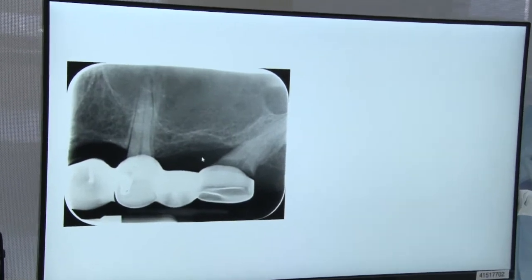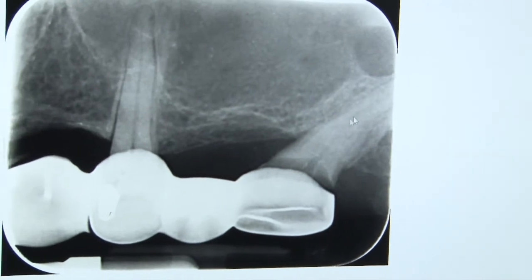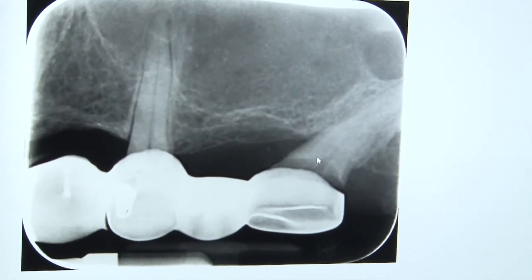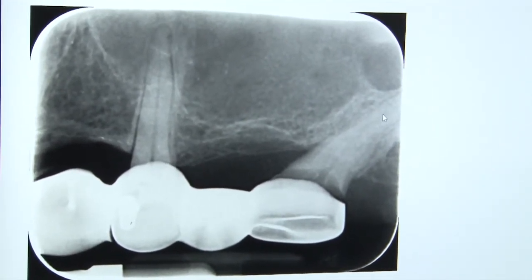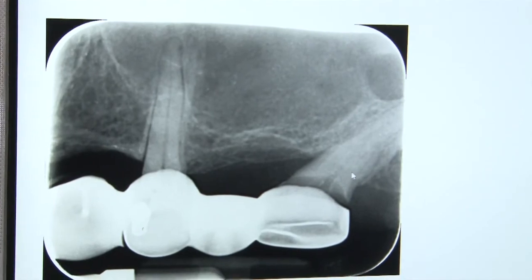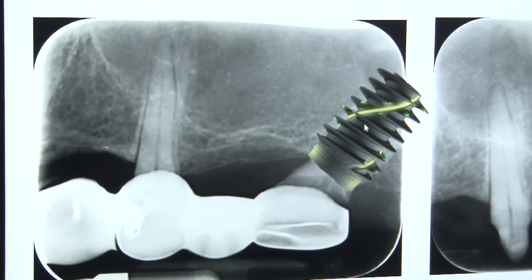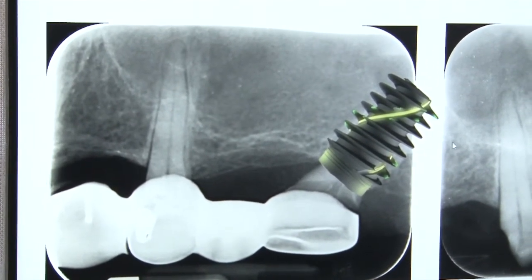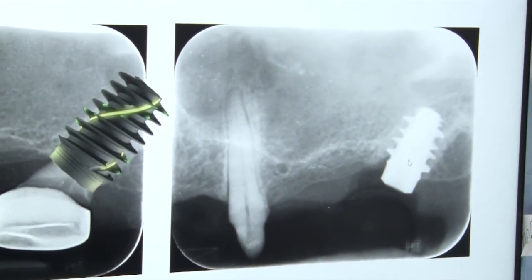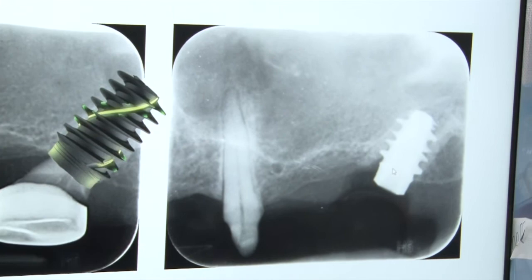Take a look at this radiograph here. The patient is obviously going to lose this bridge and this tooth, but wouldn't it be amazing if we were able to extract the tooth and to be able to place an implant directly into that socket? We can do a junction between a natural tooth and the implant further in treatment, but it has turned out to be surprisingly very easy to place an implant into the site. Take a look at the implant placement on the same day as the surgery. I have to tell you that the primary stability was close to 55 Newton centimeters when I torqued that implant into place.